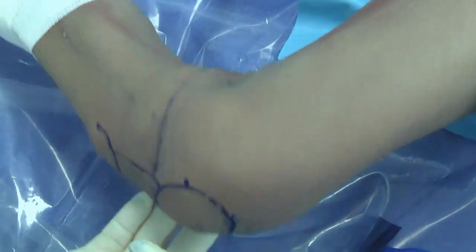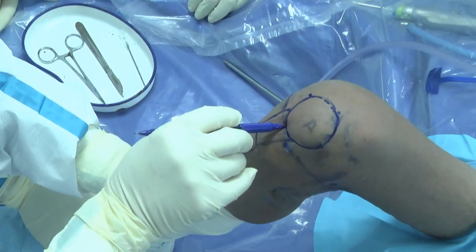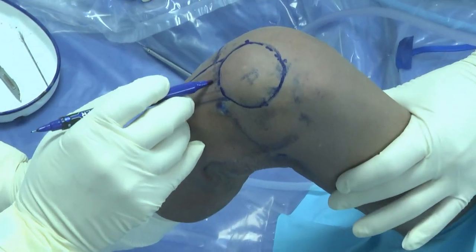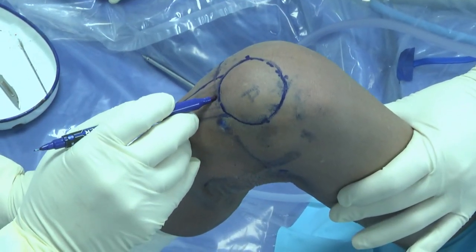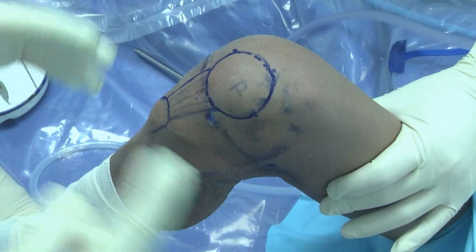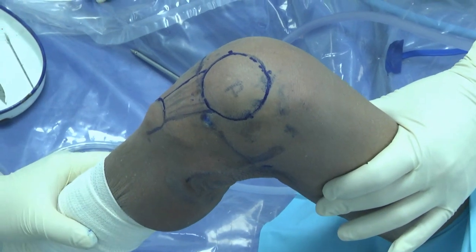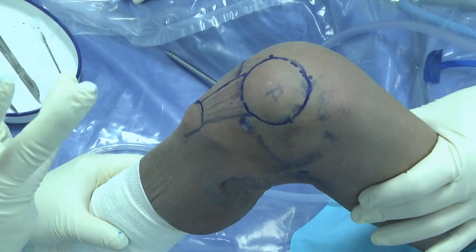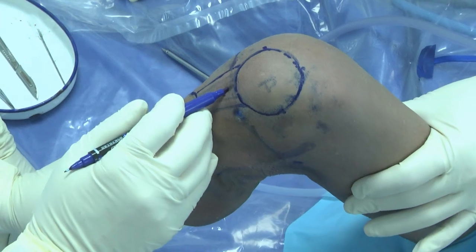Okay, good. So those are our main portals for knee surgery. There are also some additional portals. Sometimes when you do an ACL avulsion, I need another portal from the center. We call this a transpatellar tendon portal. It's good for suture management, like in shoulder surgery, where we also have a dedicated portal for sutures.